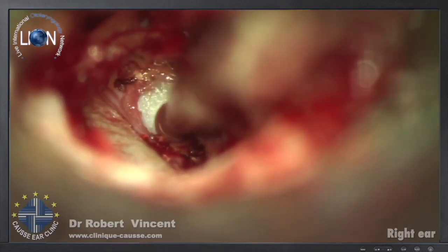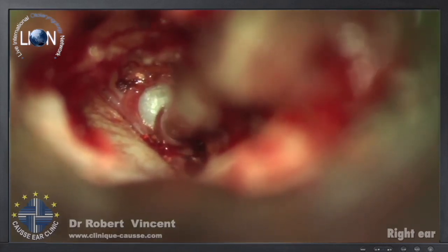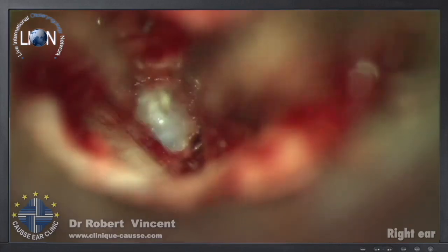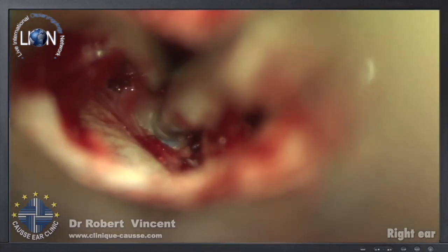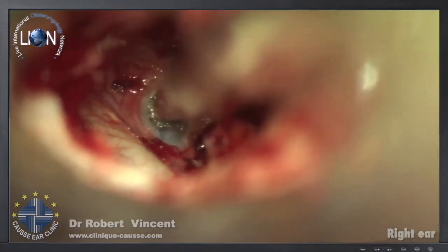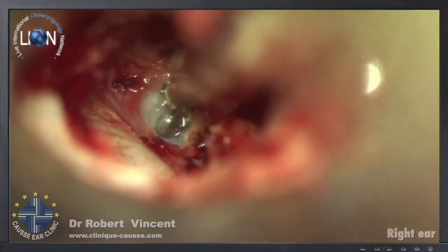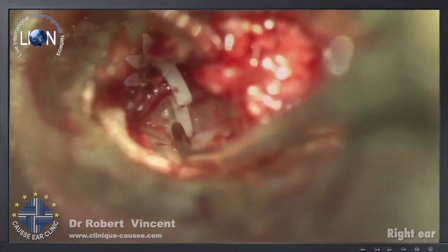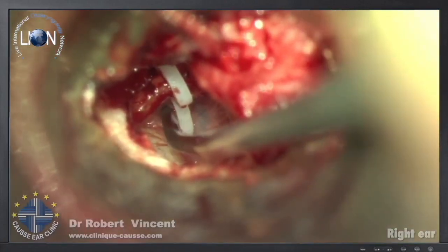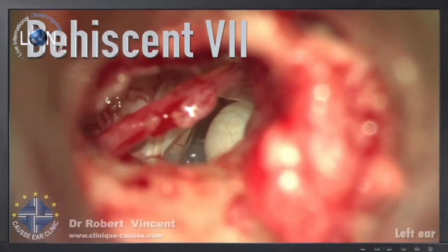I just use the diamond dust burr by itself, just leaving the burr doing the job without any pressure. But I'm enlarging, you see the drilling out. I mean, it's important not to drill out strictly perpendicular. I'm just enlarging the field just to decrease the thickness of the footplate until I reach the blue line, which is the perilymphatic membrane, and then finalizing the stapedotomy. The other point is that I'm measuring at the end to be sure that I will measure at the right length. Otherwise, there is the thickness of the footplate at the beginning. So we need to take this into account.